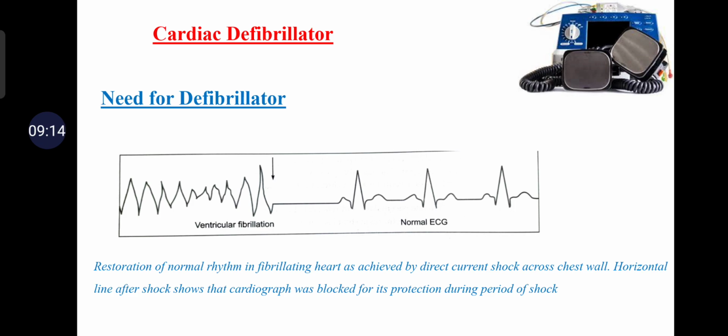So ventricular fibrillation can be converted into a more efficient rhythm by applying a high energy shock to the heart by means of an external instrument. This sudden surge across the heart causes all muscle fibers to contract simultaneously. The fibers may then respond to normal physiological pacemaking pulses. The instrument for administering the shock is called the defibrillator.